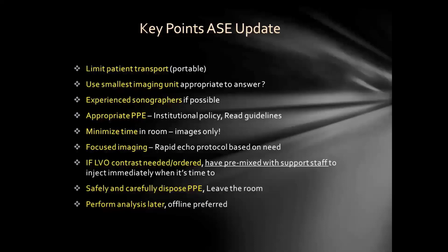If you want to use LVO contrast, or you need to use it and it's ordered and indicated, then as their video will show you, and again, I would highly advise you view the video, have the contrast pre-mixed, ready to go, with a nurse available who's donned and ready to give that contrast. As soon as you do your very few images, they should be ready to inject it. You take the rest of your images and then move on and get out of the room.